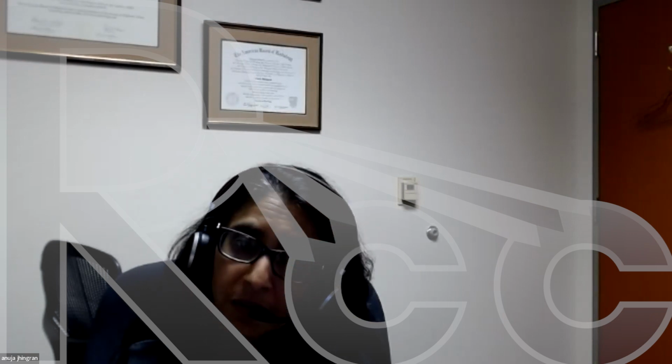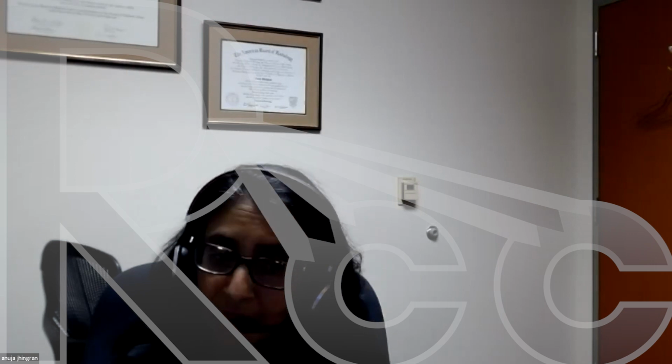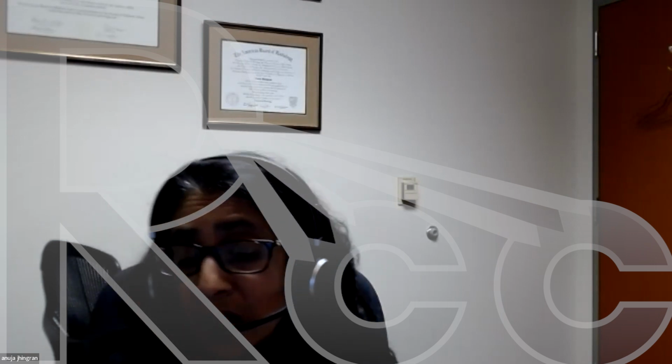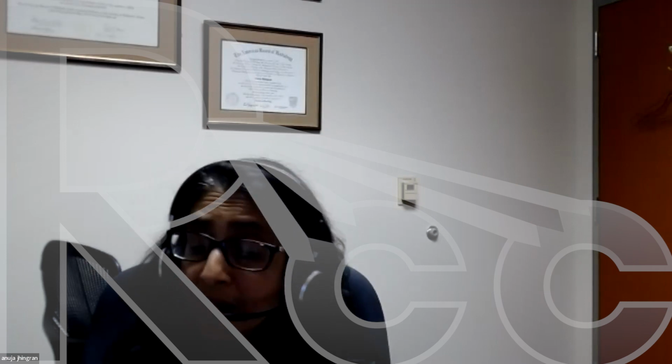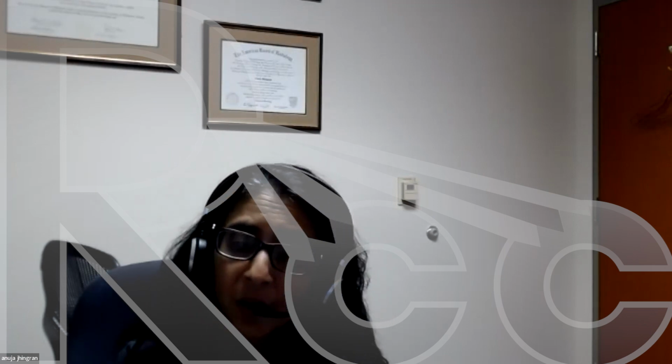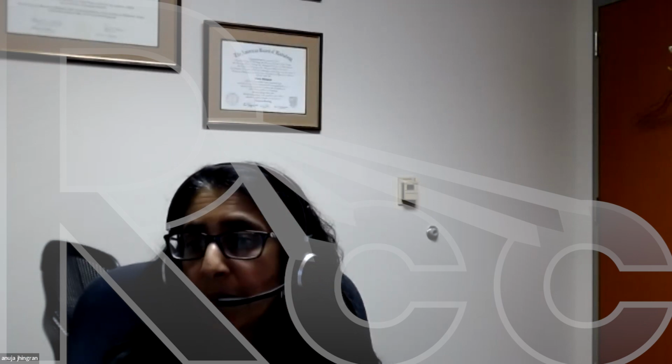Yeah. So the next question is, how often do you do cone beams during treatment? We do it once a week, unless there's issues. If there's issues, then we'll do it every day. If there's a lot of change in my ITV between my empty and full, I may do it daily. If there's a lot of gas in my rectum, or stool, and I couldn't get it out, then I may do it even every other day. If there's a lot of stool or gas in your rectum and you just really can't make that go away, the first 3 weeks are going to be constipated because of the surgery.